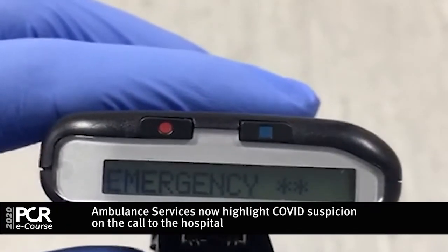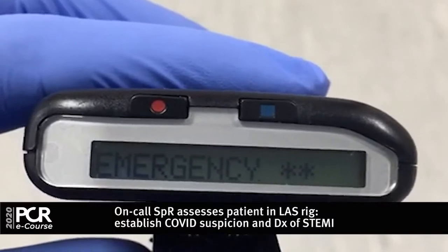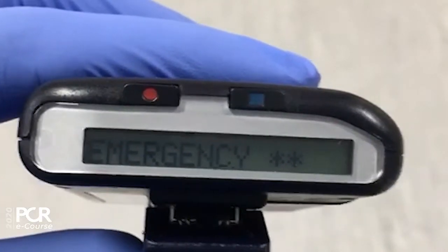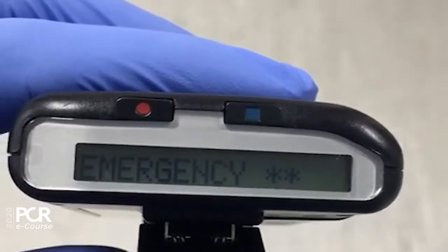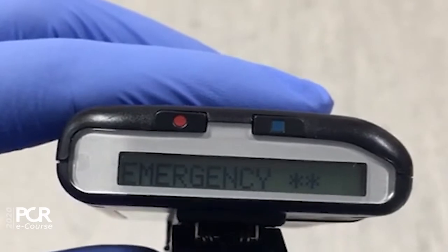Primary angioplasty, suspected COVID coming from LAS, going to the heart, ETA 10 minutes.